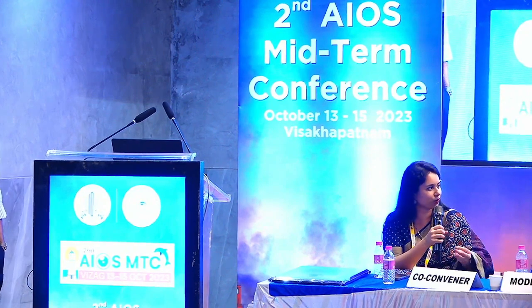So to the panel, I wanted to say there are so many confusing nomenclatures coming, advanced monofocals. I think with the ANSI classification, don't you think they all come under an EDOF category? An EDOF has so many different ways of working. There's a hybrid EDOF, one which works with aberrations, there's a pinhole effect, and many such.